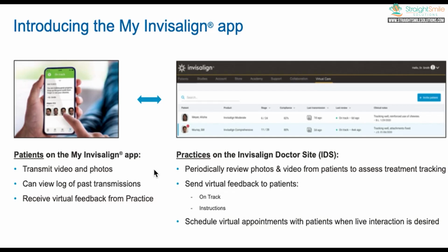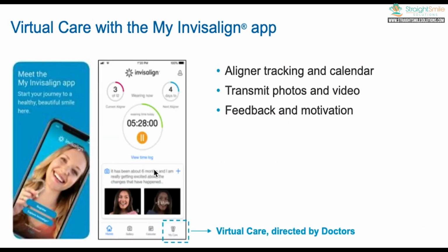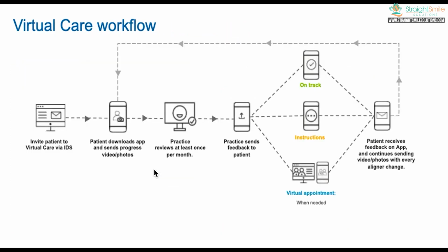There's nothing proprietary. Obviously, Dental Monitoring has the AI built into what they're doing. So if you're really busy, you want to use them because the AI is in there and it tells you things without you having to even know it. But if you're not that busy, you can use Invisalign, which is basically just a photo, and you'll just need to screen it, but it's free. So aligner tracking, compliance, stuff like that. So basically, that's pretty much about it.